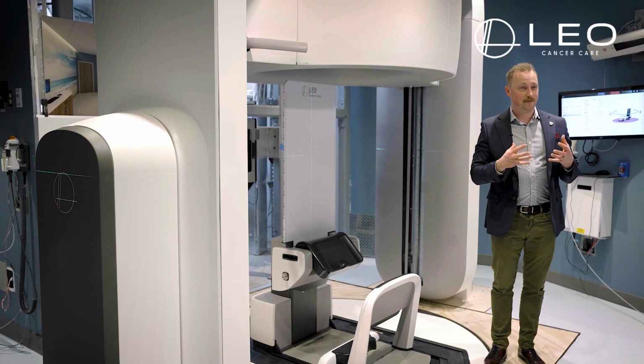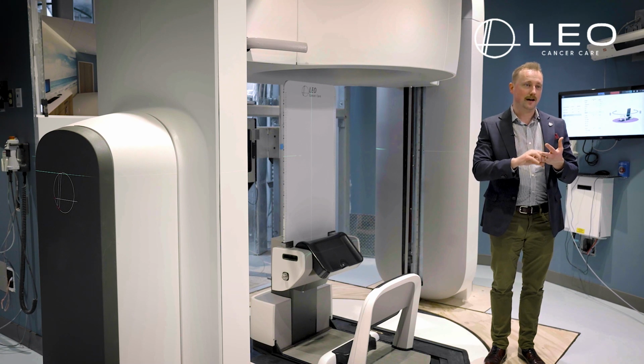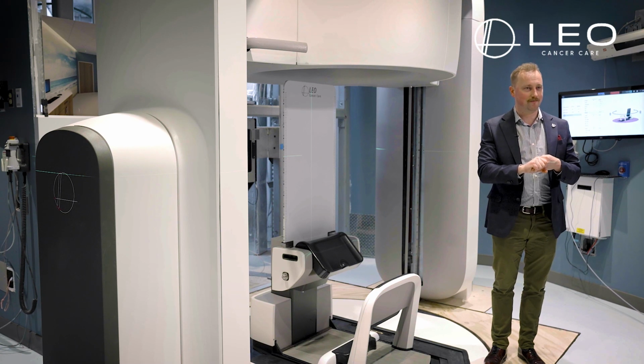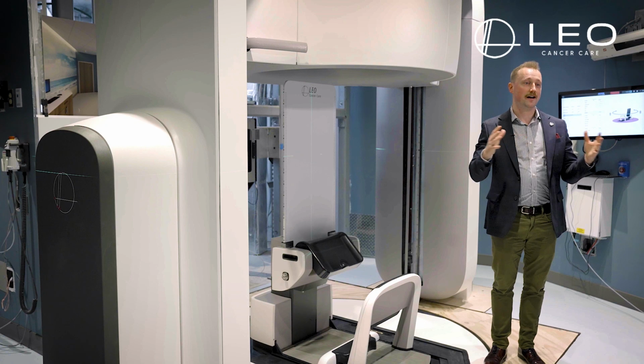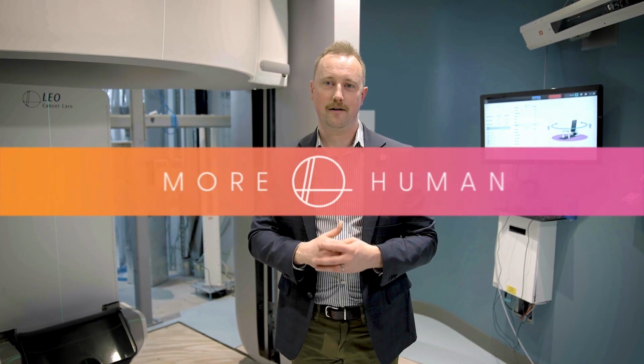Leo Cancer Care is committed to bring all of the financial, clinical, and emotional benefits of upright radiation therapy to the entire oncology space. We're going into proton therapy, carbon ion radiotherapy, photons, flash electrons, BNCT. All of these different modalities are being enabled by the power of upright.